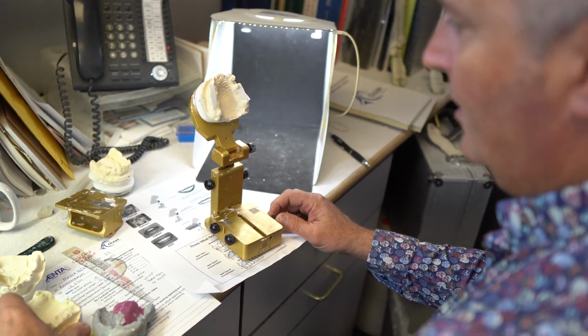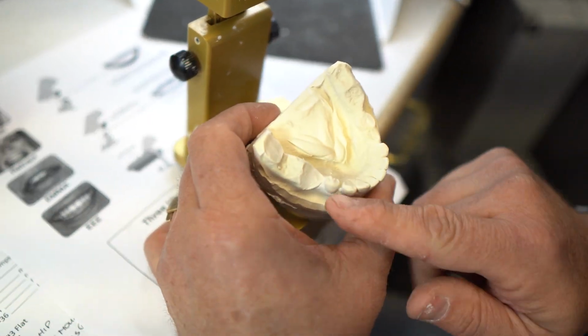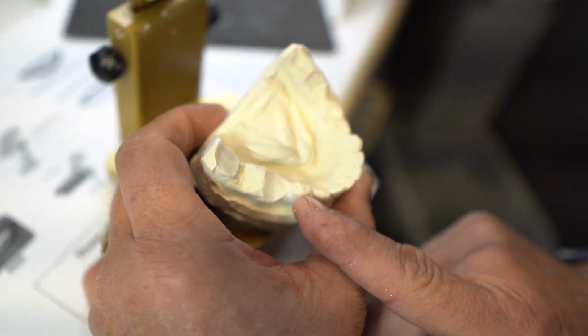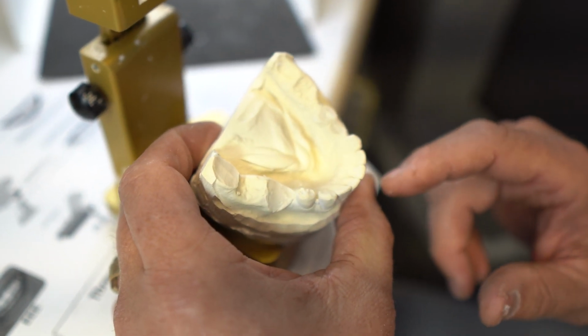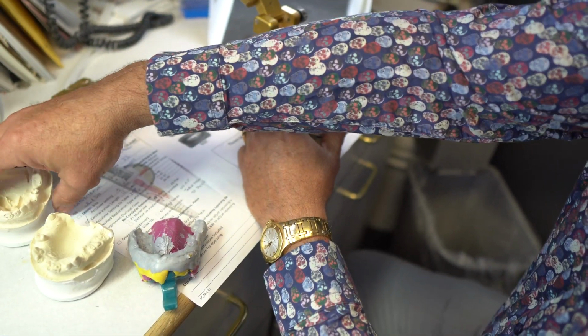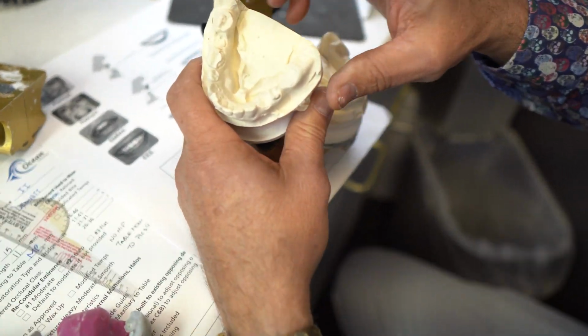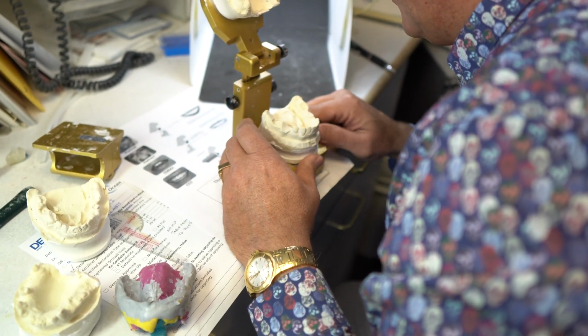So on the lower, the doctor is going to preserve these teeth, okay, from the 4-4 to the 3-3. And these are all getting extracted. They're all bombed out teeth anyways. You can kind of see here, this was before I extracted them. It's just the teeth are not salvageable.